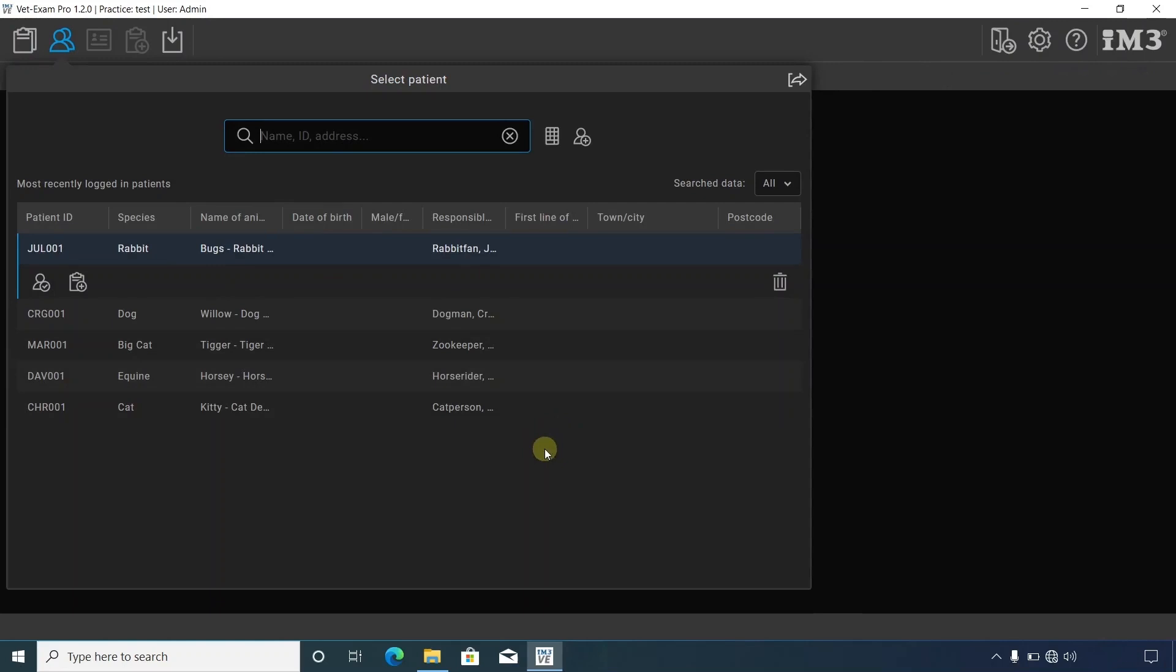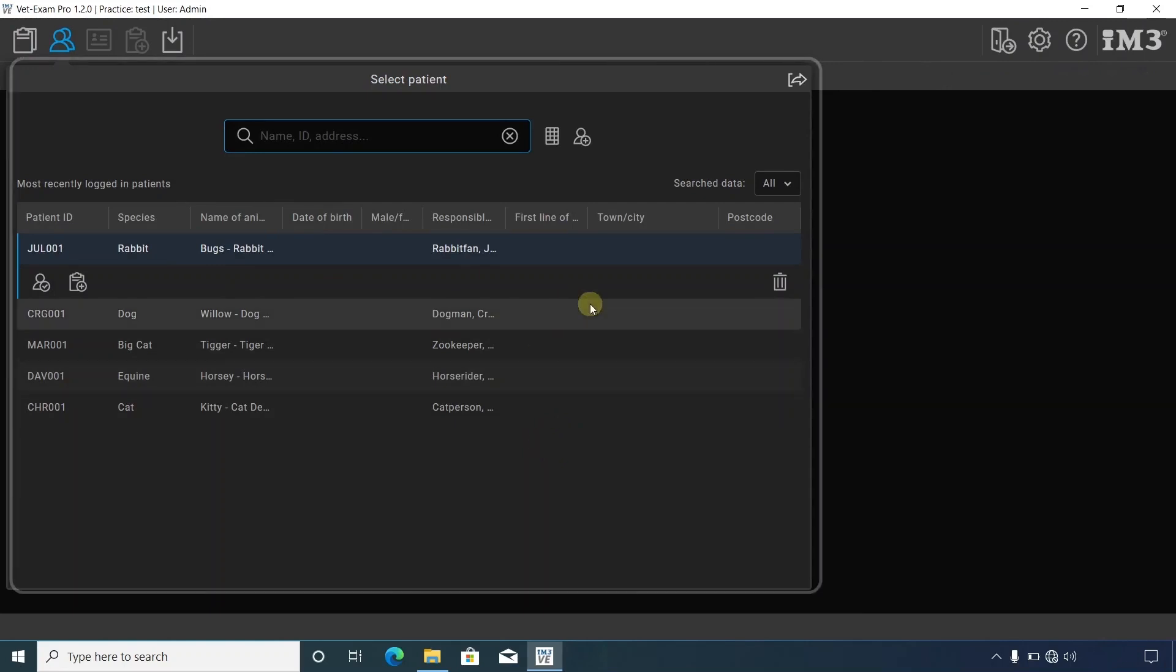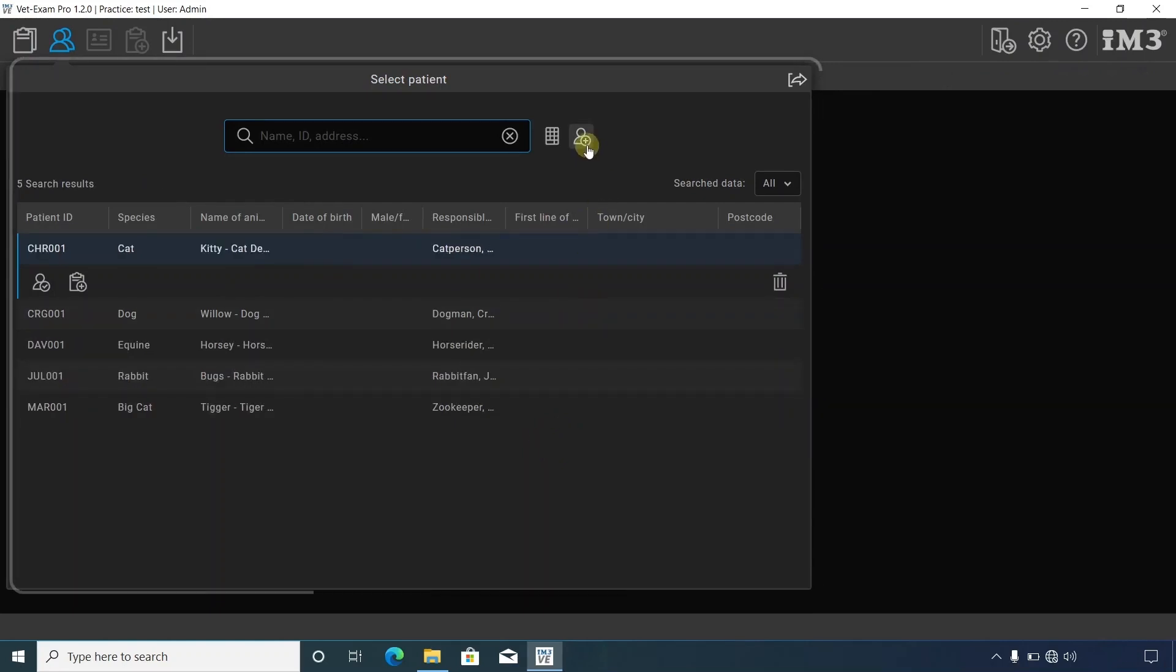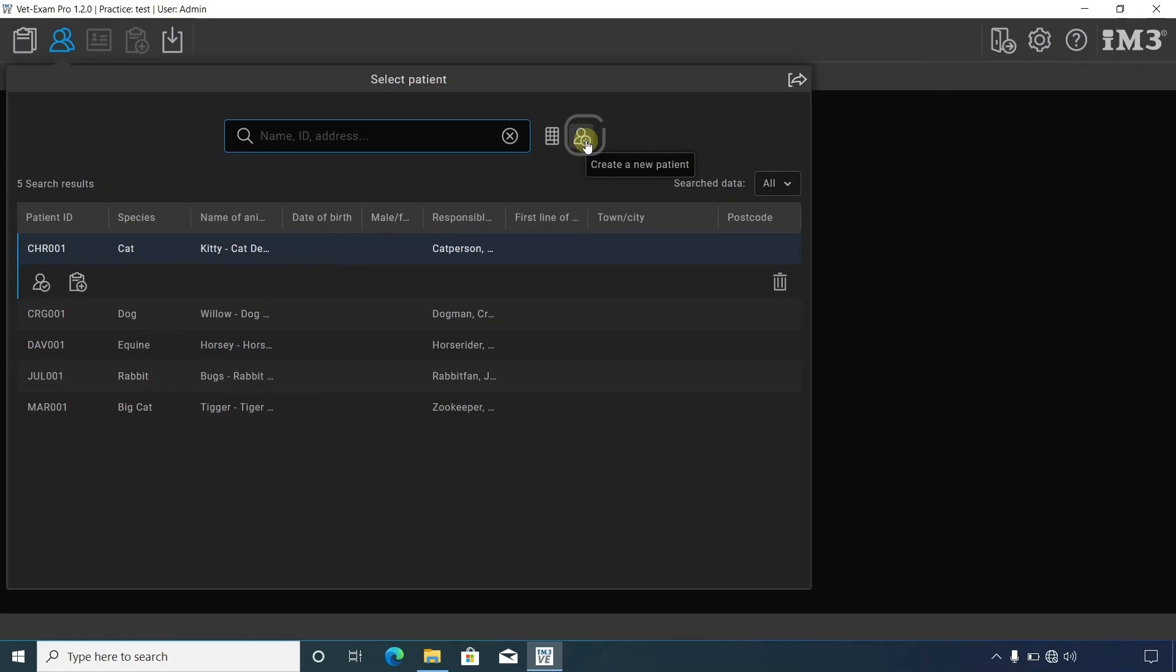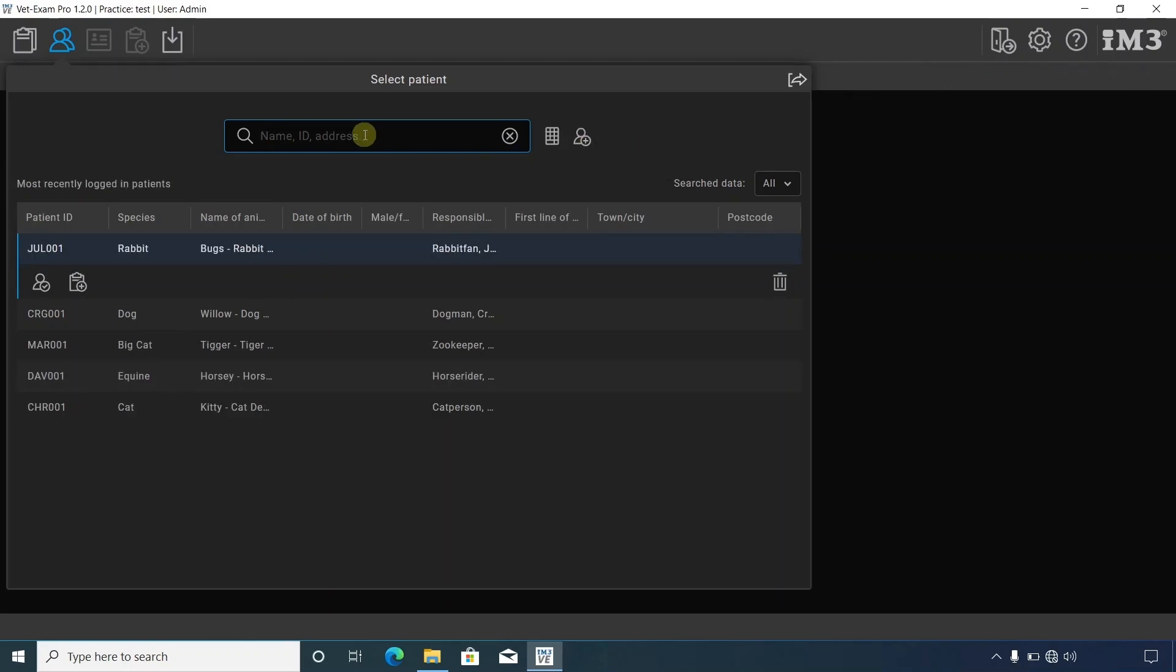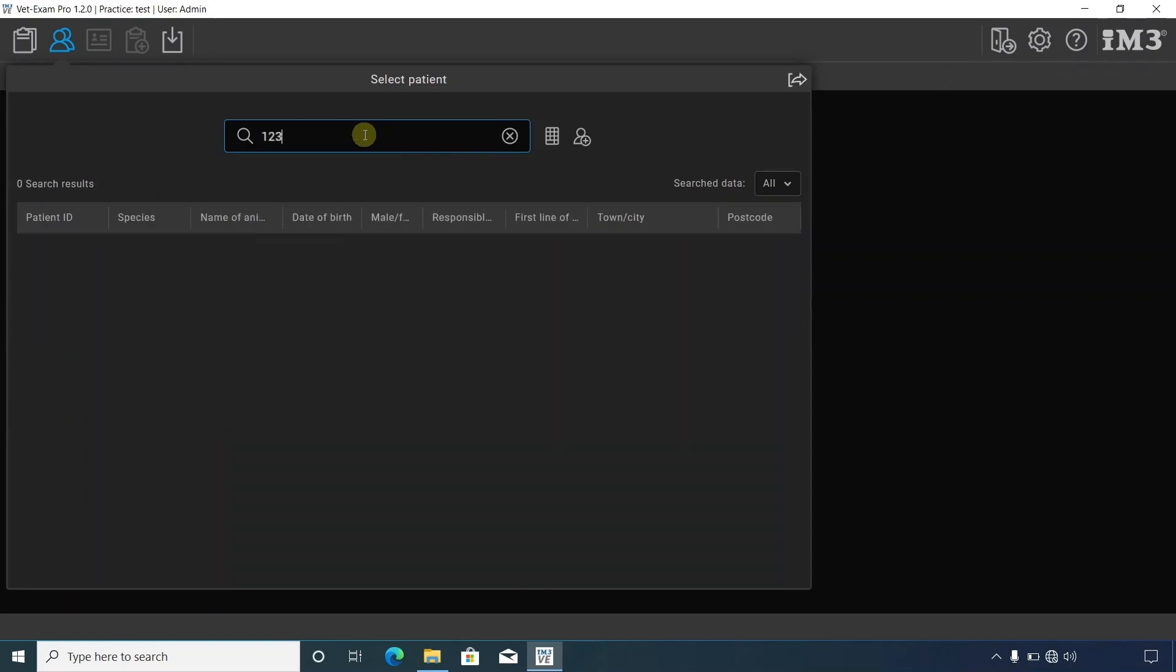The select patient window will open up automatically. To create a new patient, click here. To search for an existing or previous patient, type in the ID or pet name here. For the purpose of this video, we're going to create a new patient.